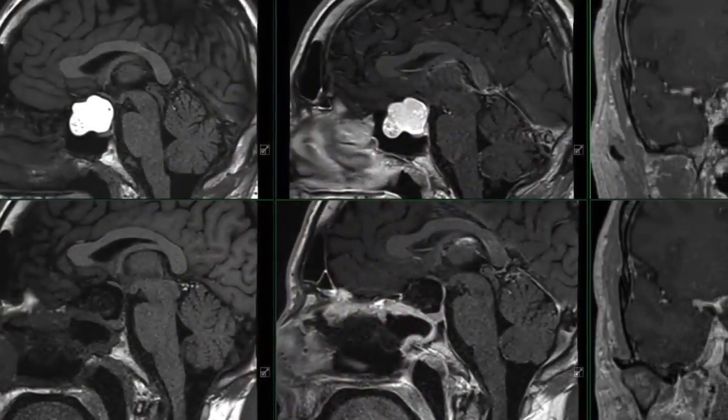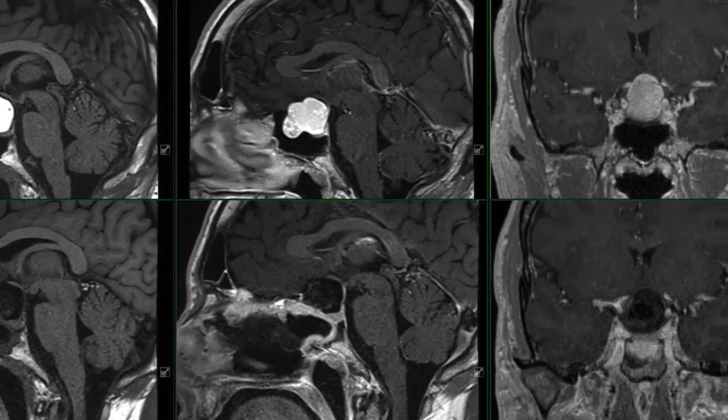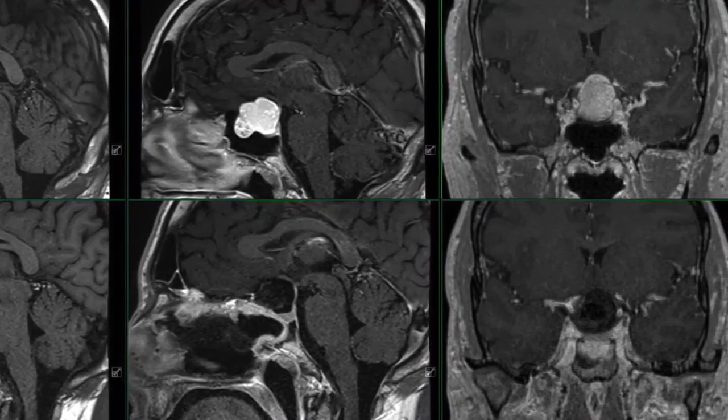As you can see here from postoperative images, there's excellent gross total resection of the dermoid cyst and an excellent decompression of the optic apparatus.